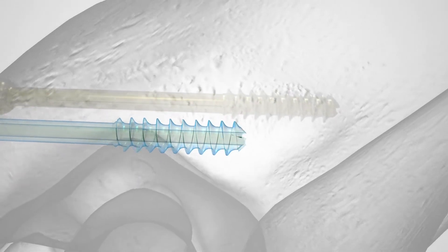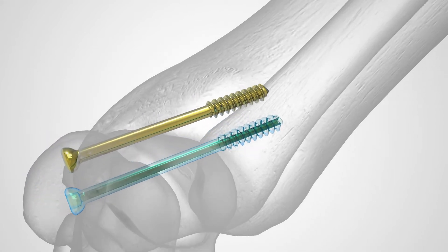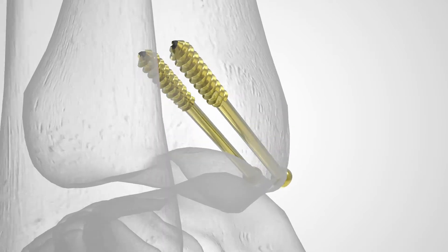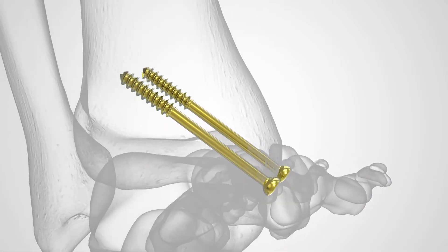The Acumed cannulated screw system consists of screws, washers, and instruments designed to provide fixation for fractures, fusions, and osteotomies of large and small bones appropriate for the size of the device.